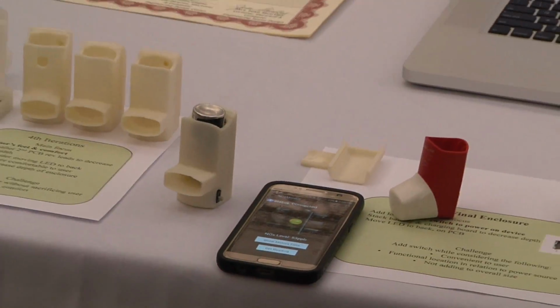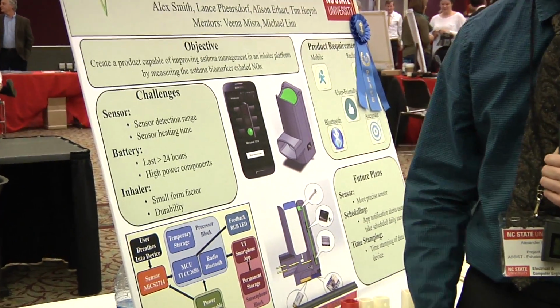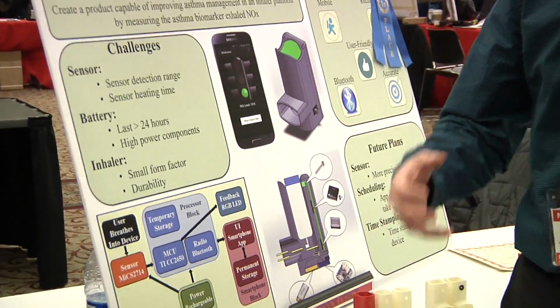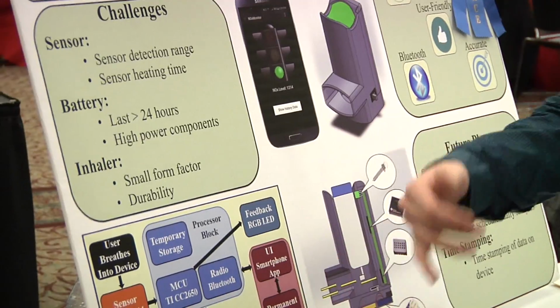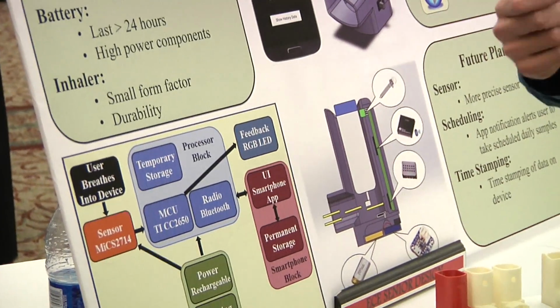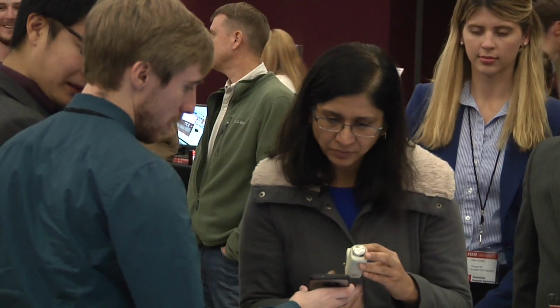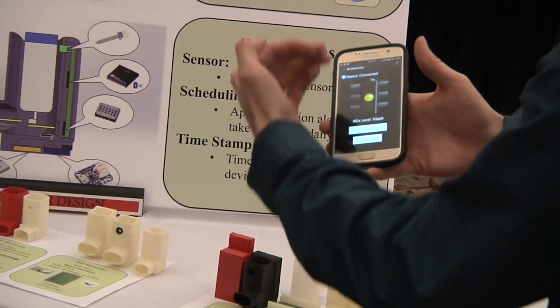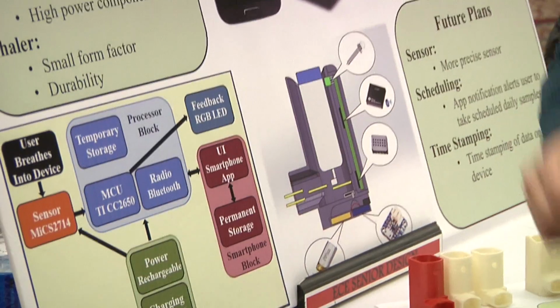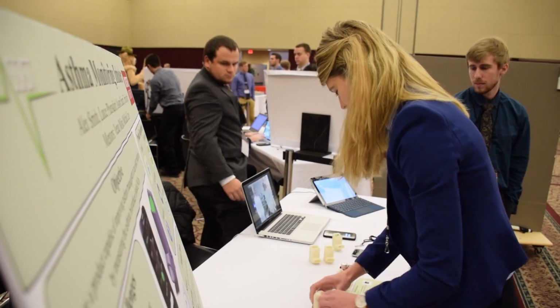So how we implemented this solution was with, first, the primary component, our sensor, which is a metal oxide sensor that is used to capture the breath and determine the chemical reading. We then pass that through to a microprocessor, which will then take the reading and send it over Bluetooth to a phone application. And that phone application will then do some processing on the signal and convert it to a concentration in the air. And then using research from pulmonologists and other specialists in the field, we can then correlate that concentration to their risk for an asthma attack in the future.